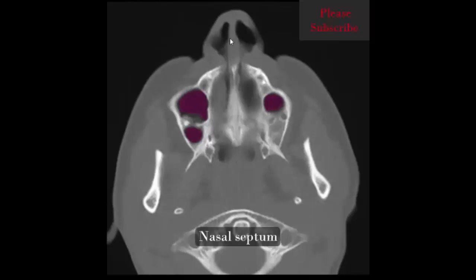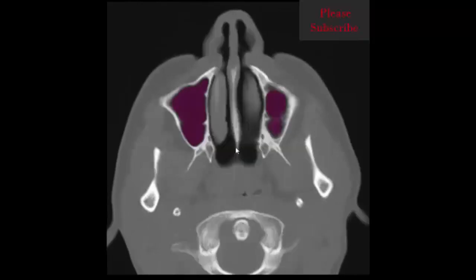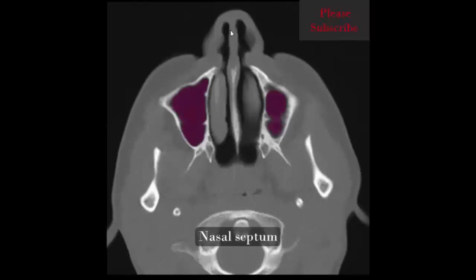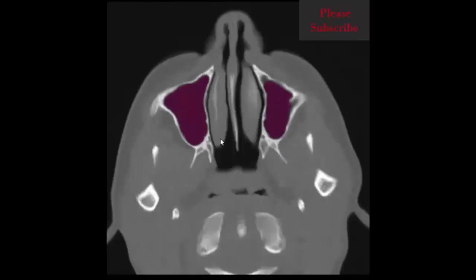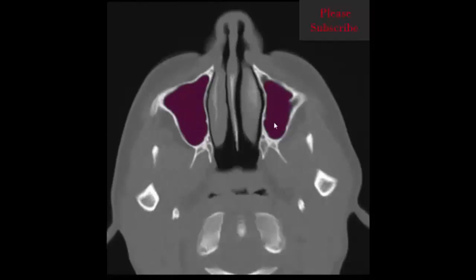On this slice we can identify the nasal septum, right and left maxillary sinus, nasal cavity, and right and left inferior turbinate.